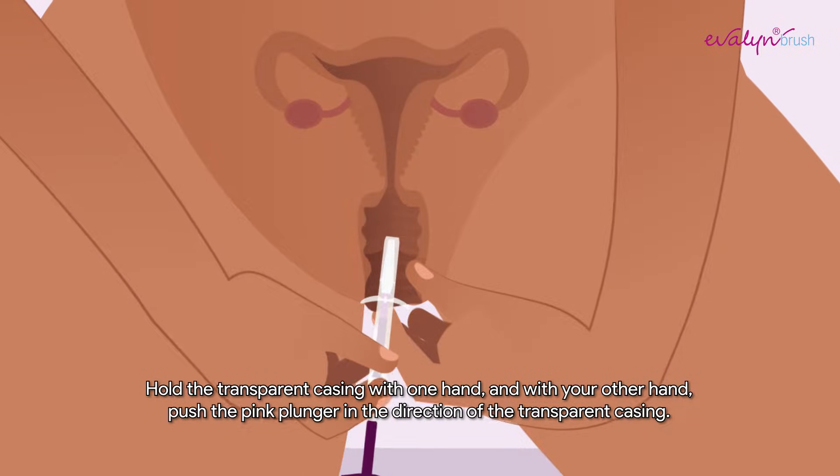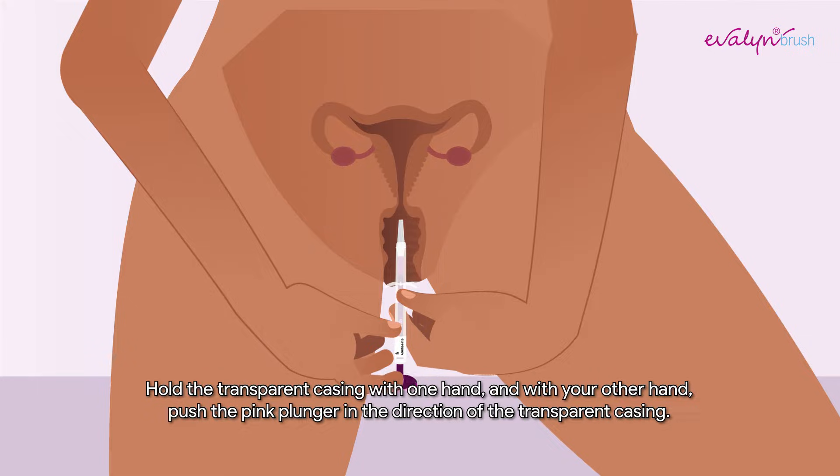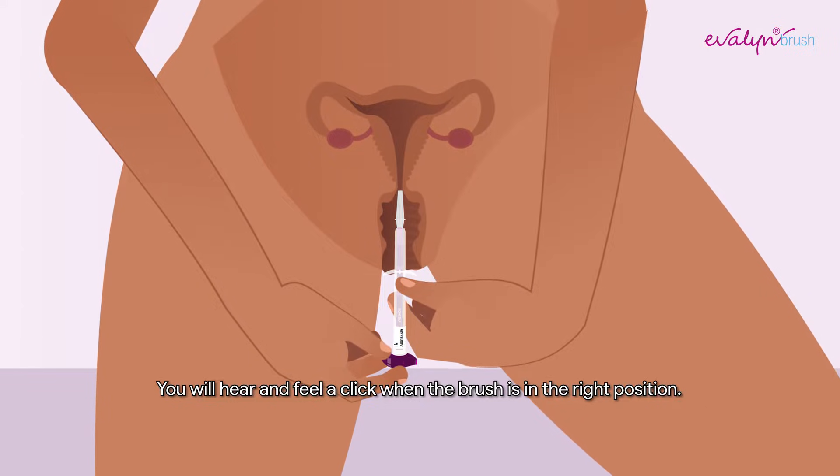Hold the transparent casing with one hand and with your other hand, push the pink plunger in the direction of the transparent casing. You will hear and feel a click when the brush is in the right position.